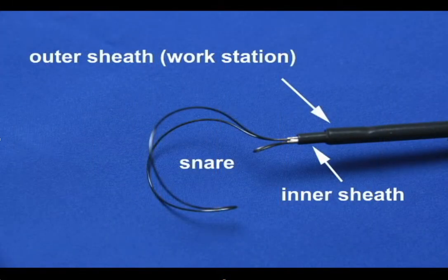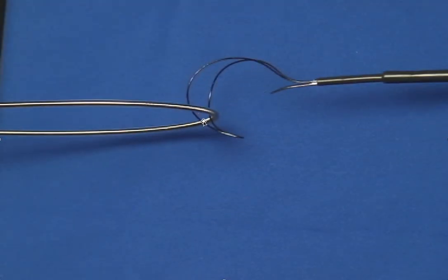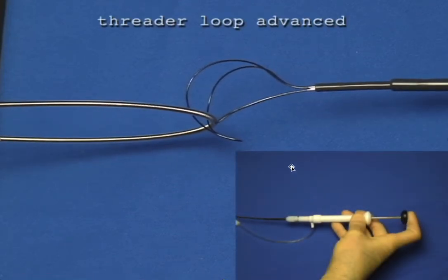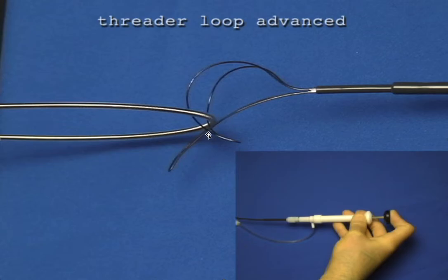And the way that this thing works is that it has the snare loop here. There's a threader loop, and then an inner sheath, and then the workstation. So the workstation, the inner sheath, and then the snaring mechanism. And the way it's designed is that you loop the snare portion over your lead and then extend the threader loop using this plunger back here. And if the threader loop passes on the outside of the lead, you're good to go.